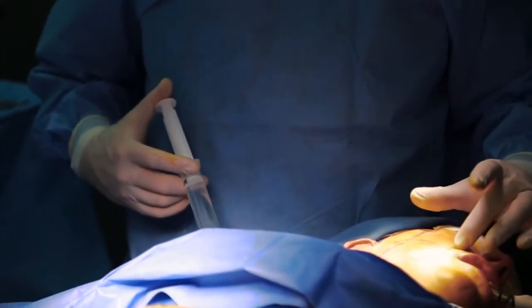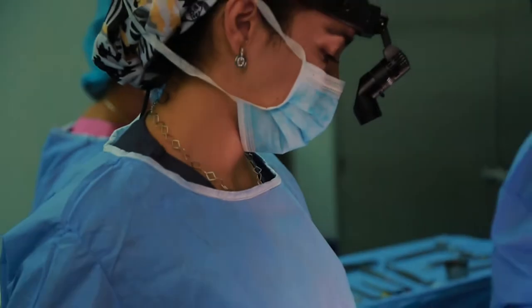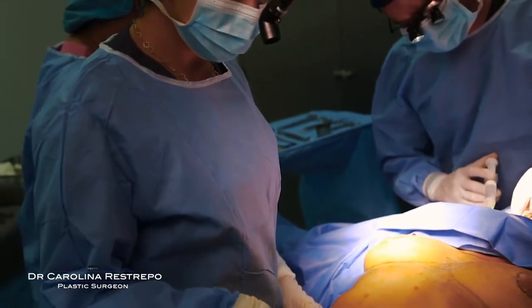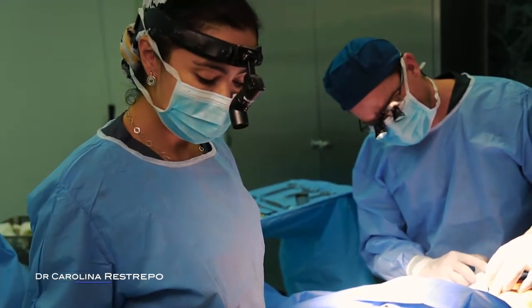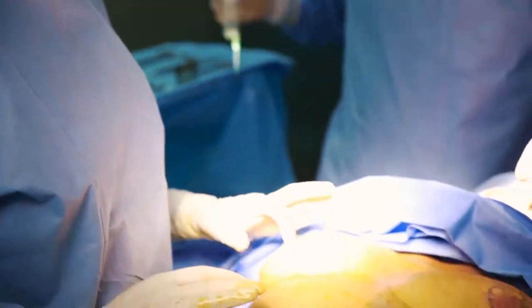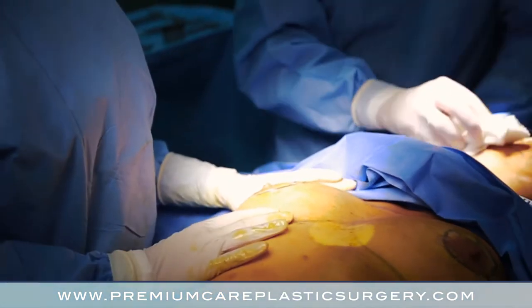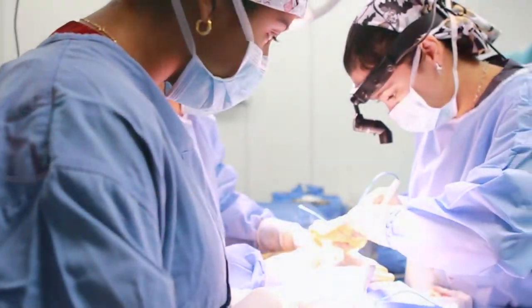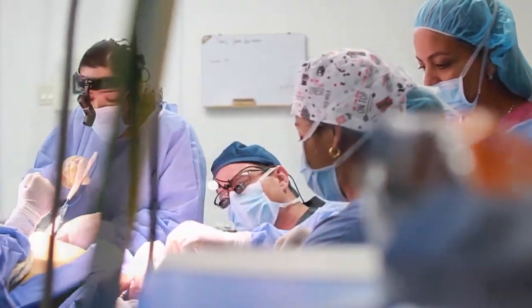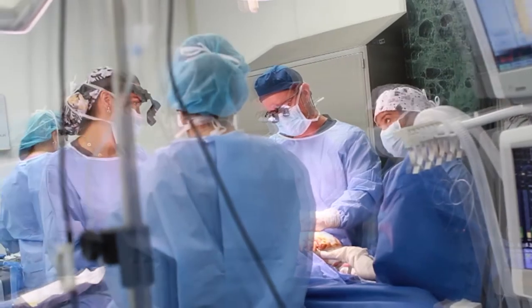We are going to do some facial fat grafting to soften some of the folds and wrinkles she has and also to give her fuller lips. Dr. Restrepo is going to work at the same time on the breasts. We are going to take the fat for the fat injection from the lower abdomen. Regarding the breasts, we are going to do a periareolar lift with an augmentation — a dual plane augmentation — to increase the volume and give a natural look to the breasts.